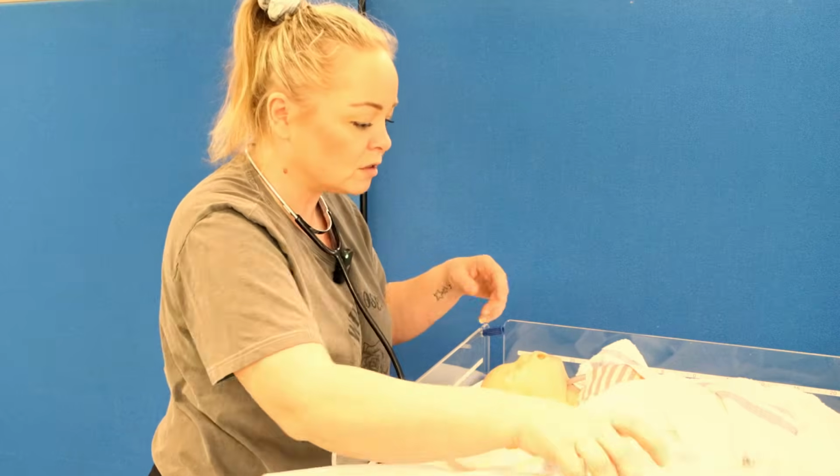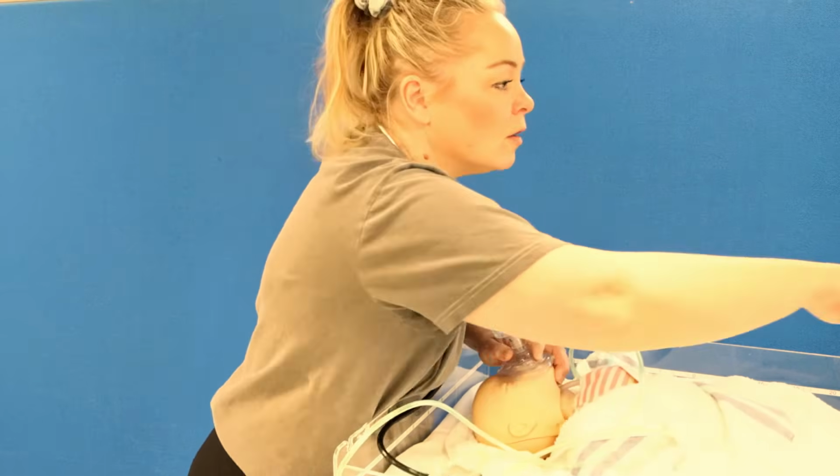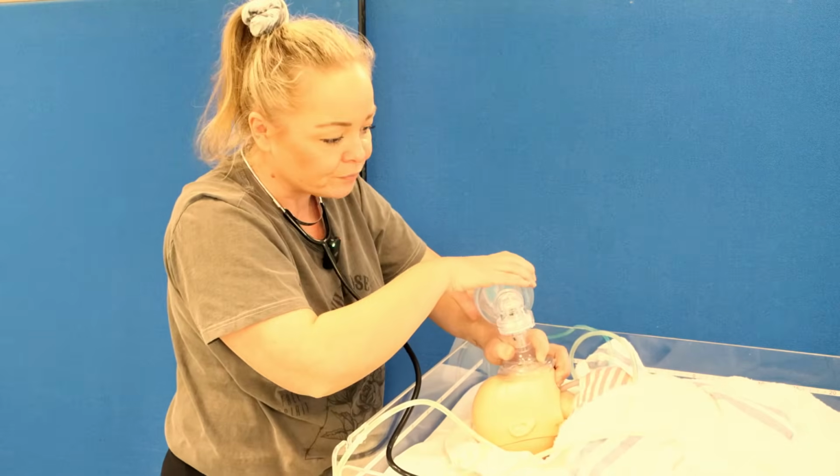So now I'm going to move on to starting compressions 3 to 1. Because I've now started compressions, I'm going to turn the oxygen up to 100%.